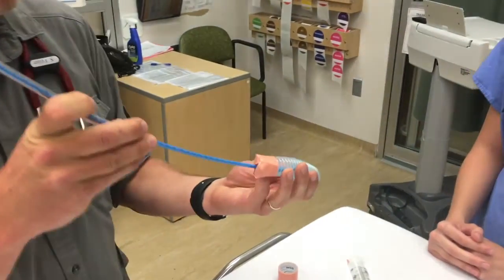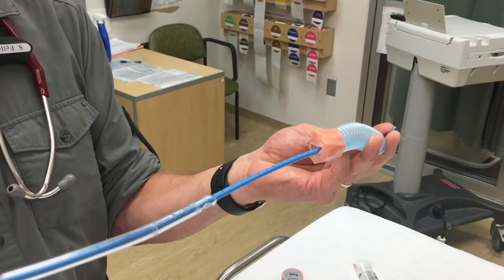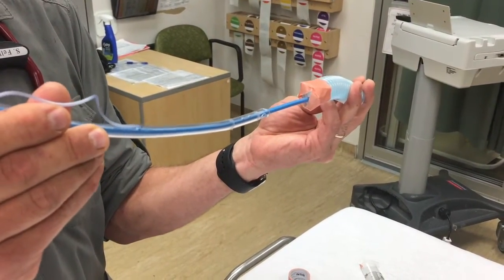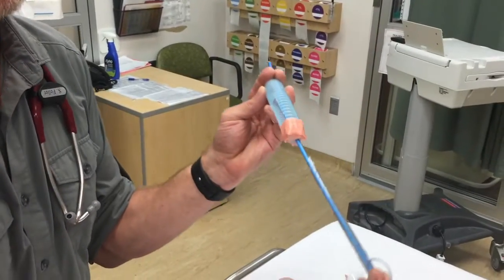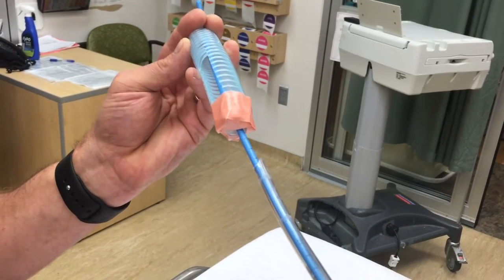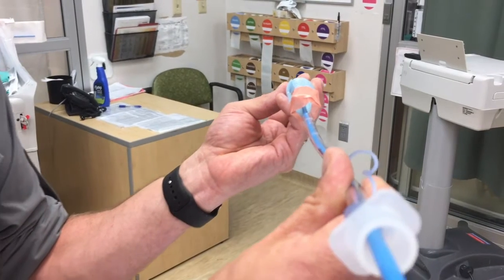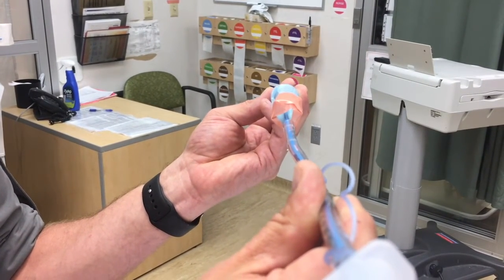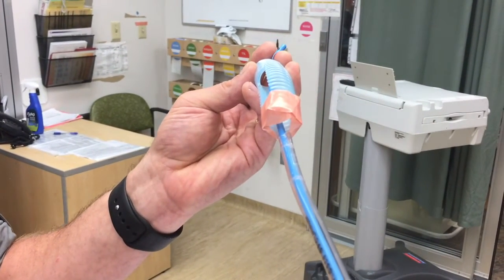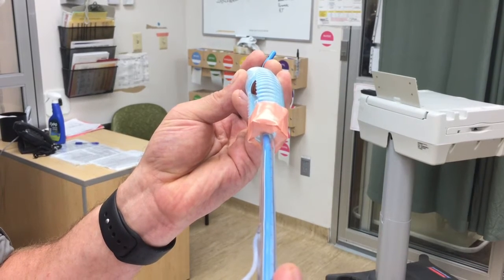When you place a bougie and reach end point or hold up, what will sometimes happen is because you're working out of the right side of the mouth and your laryngoscope will still be in, the leading edge of the bevel is facing the right. So you'll sometimes hit these right-sided paraglottic structures, and we can manage that by rotating to the left — counterclockwise. That takes the bevel off the right-sided structures, puts the bevel face down, and now it will sail through.